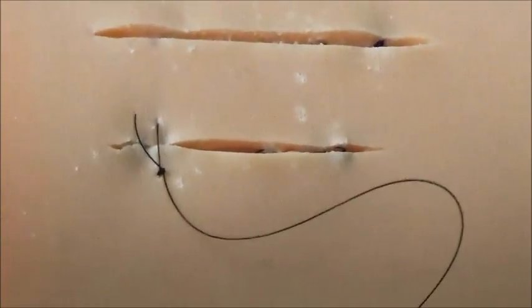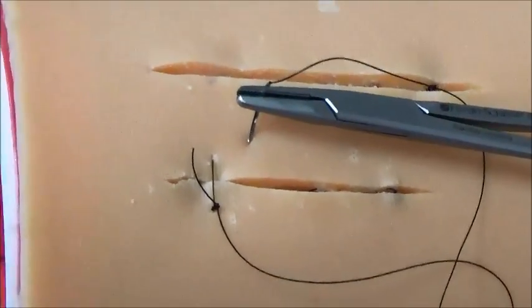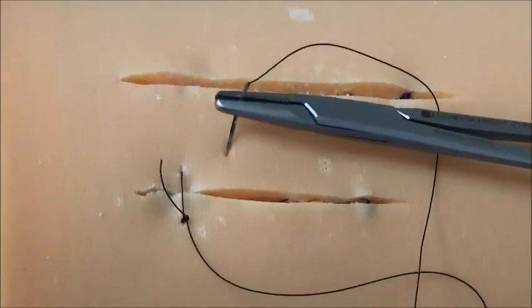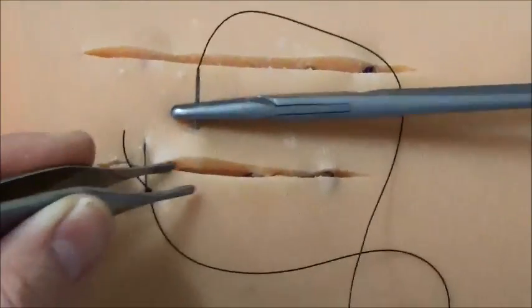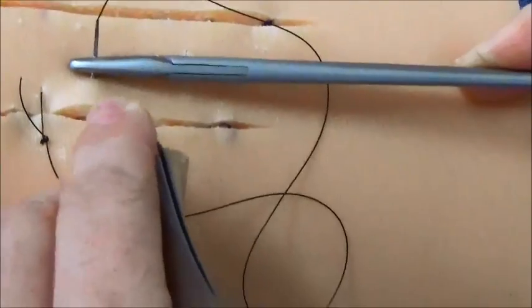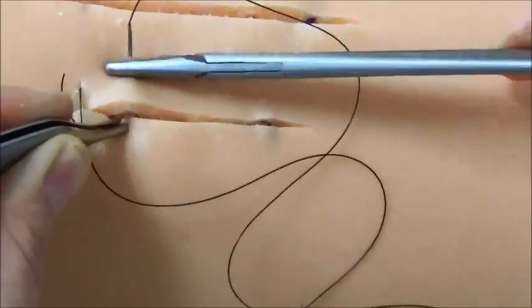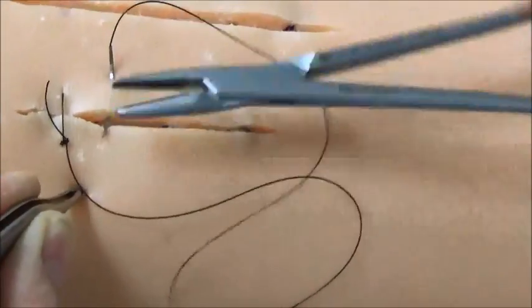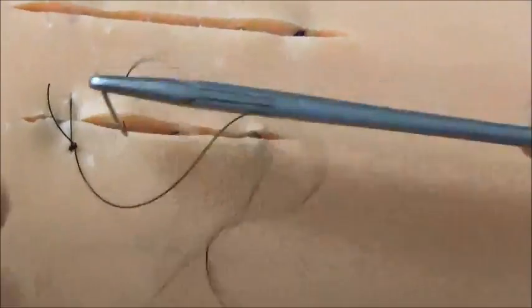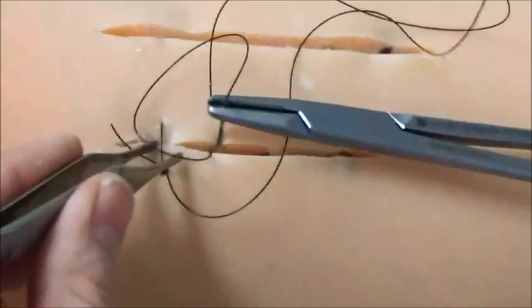So when I create my next bite, I'm going to basically take what would look like another simple interrupted bite or simple continuous bite. So I'm going to come about 8 to 10 millimeters down from the first bite, so a little bit farther than usual, and about 5 millimeters back from the cut edge. If I need to come up in the middle, then I can do that. The curvature on this needle is rather shallow, so in this case I'm going to need to do that.